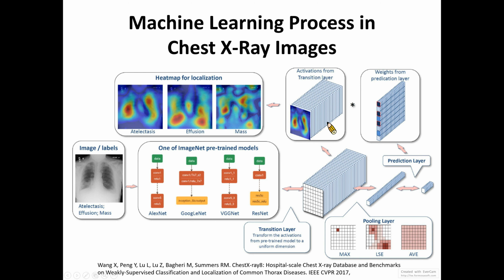However, if you have the patient do chest CT images, then the abnormality rate will increase to 86%. This means that CT is more sensitive in detecting abnormalities in the case of COVID-19 or SARS-CoV-2. That's why many countries have already adopted CT as a standard procedure to evaluate lung conditions in COVID-19 victims.